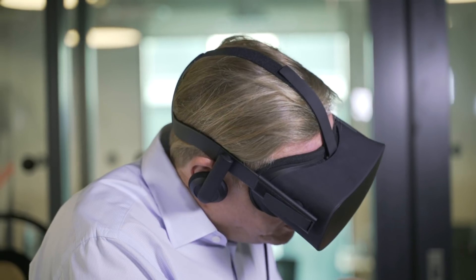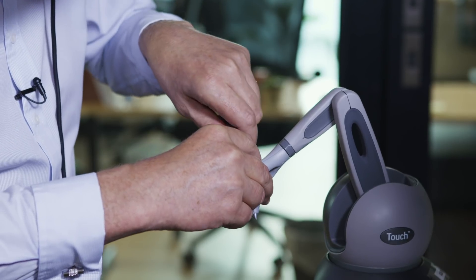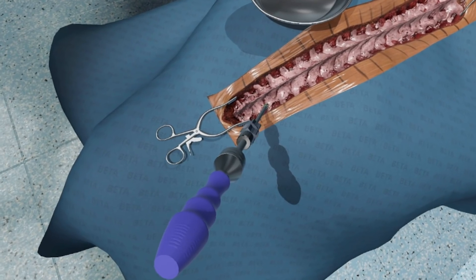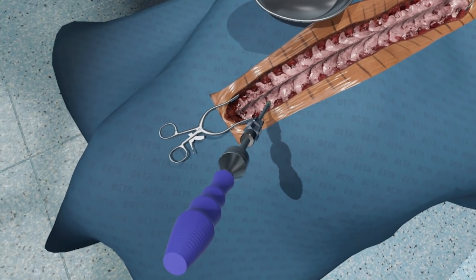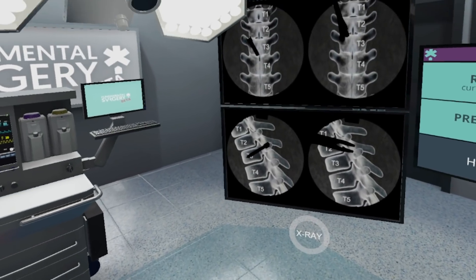We can now use the screwdriver to put in place the pedicle screw. At any point I can take an x-ray to see how well I'm doing — and yes, there is the screw.